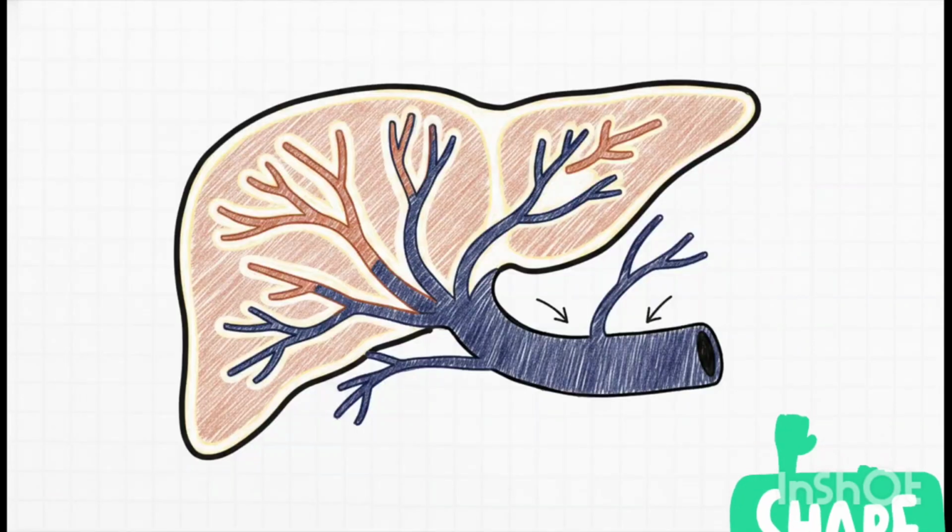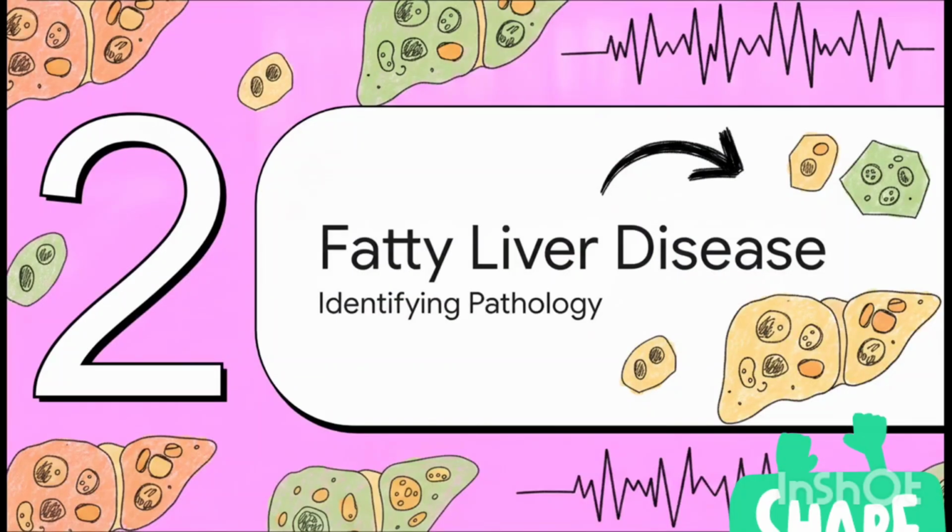Now, notice how we differentiate the vascular landmarks within that smooth gray canvas. This is such a crucial trick for training your eyes. If you look closely at the portal veins, you'll see they have these bright echogenic walls that practically glow against the background liver tissue. Contrast that with the hepatic veins, which you can actually track draining right into the inferior vena cava. Those hepatic veins don't have those bright walls at all. They're much, much more subtle. Recognizing the specific structural difference in the vessels is a massive part of confirming that you're looking at a healthy baseline.